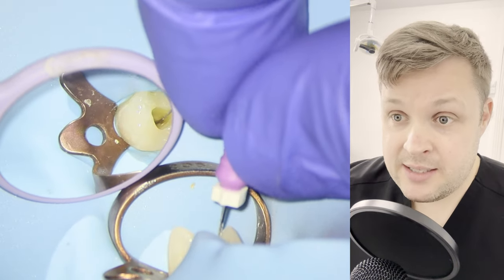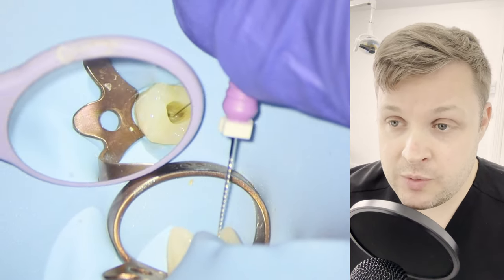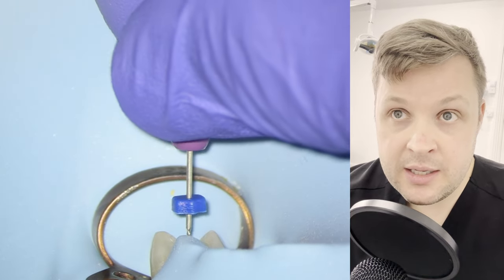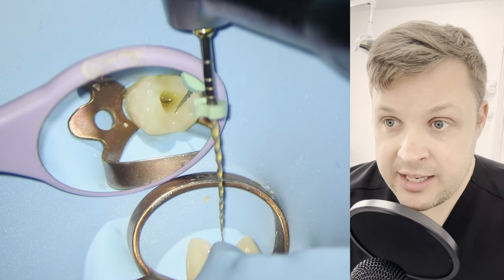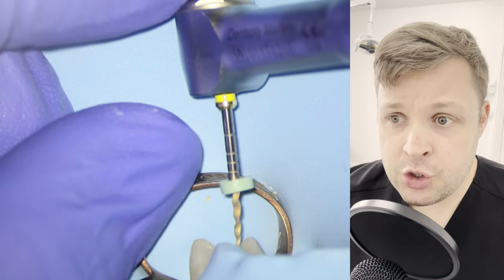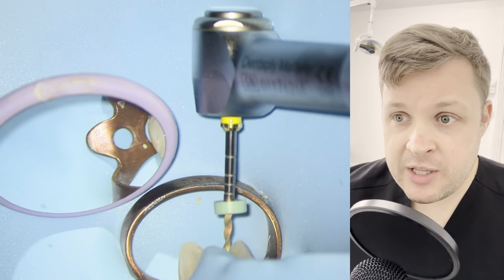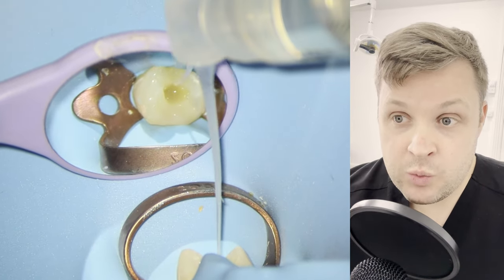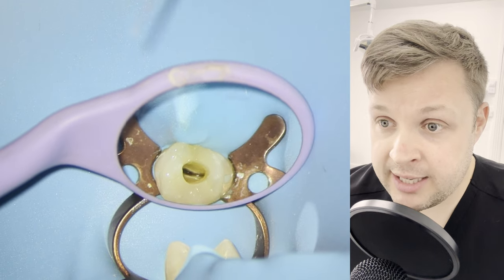So I'm going to go straight into root canal mode now. I'm just using a size 10K file just to gently explore the coronal to mid-third. I'm not going to go anywhere near the apex with these. I'm just gently exploring, and then I'm going to use a high-flex 20-05 just to expand the coronal third and get that all nicely open. You'll notice that when you expand the coronal and mid-third, the hand files will more easily get to length, and you're less likely to transport or ledge the tooth.